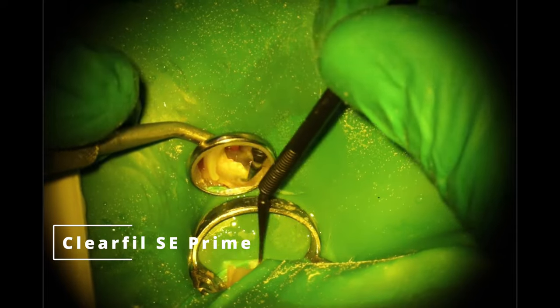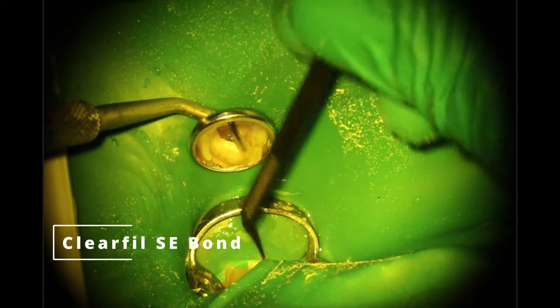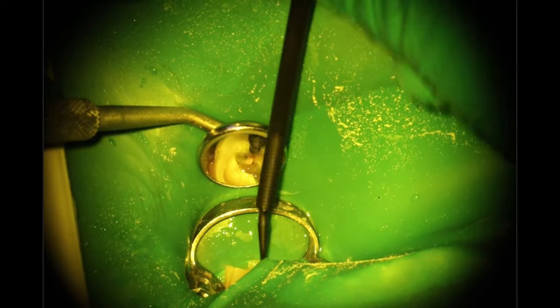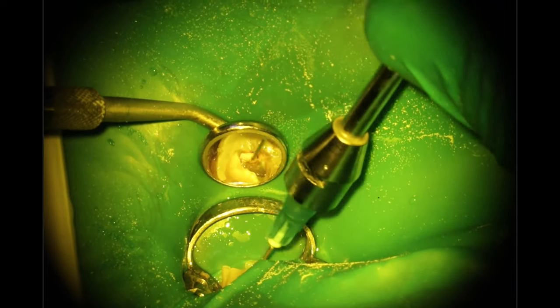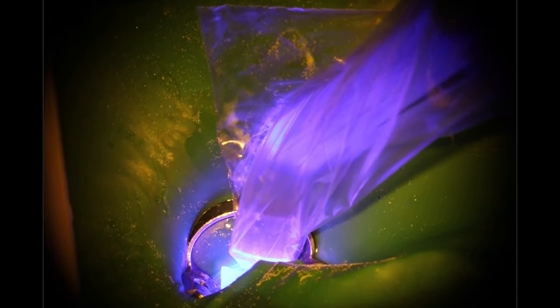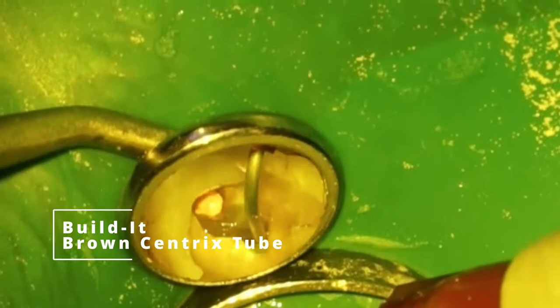The rest of this case is pretty straightforward. That air abrasion works so well for getting beautiful looking pictures. New stuff just came in the mail — it contains silane in it, so when I'm restoring any porcelain teeth I don't have to silane separately, which is great. Going in with the Bond Air thin, light cure, just like we normally would. On cases like this that are a little bit larger, sometimes you do have to go back in — one dip may not be enough. One of the keys as far as being efficient is to make sure that both of you are always doing something. When I'm working, the assistant is cleaning up, working on the note. She has the Glick at the ready because I've already told her that's what I'm going to need next, and you can see the passing is almost like they anticipate what's needed because we've done it so many times. Having standard work is the key here.